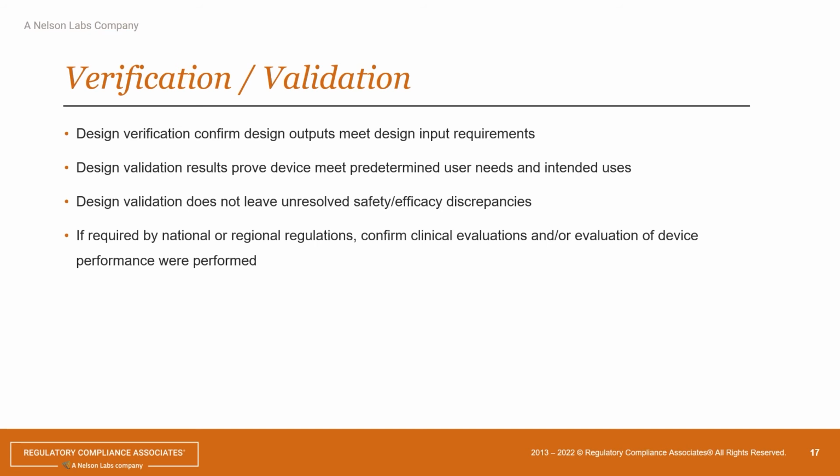So with verification, this is all about: I define my requirements. IEC 62304 basically looks at three things: unit verification, integration, and then system software testing against your requirements. So you do all of those. IEC 62304 does not talk about validation. That happens at the system level. So all your usability testing, for example, IEC 62366, your clinical stuff, all of that is outside of the scope of IEC 62304.